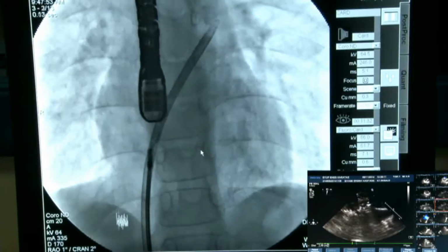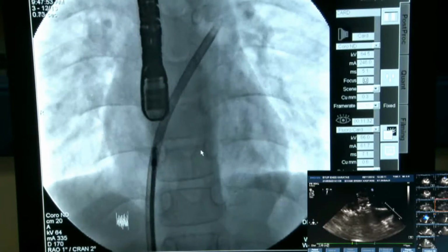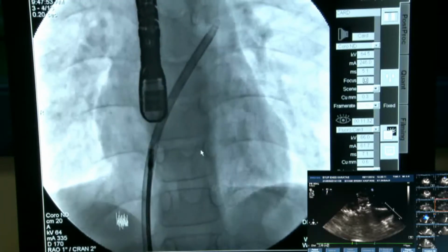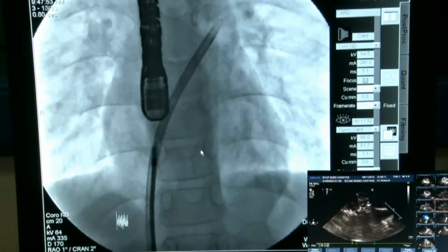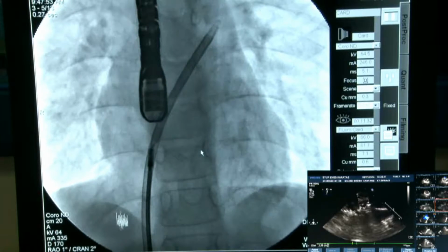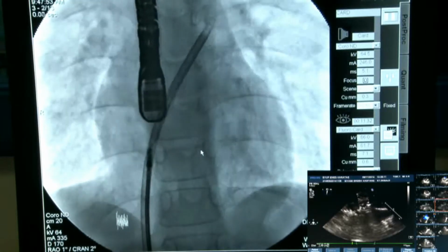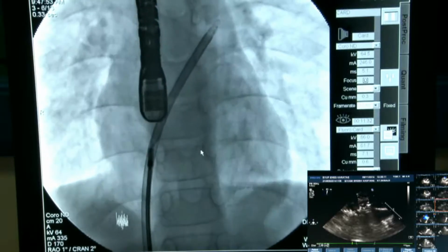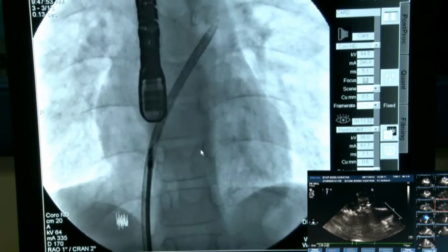We discussed here also to prefer 15 or 16 and a half. And what do you recommend? 15 I think, right? Yeah, I think the salon recommends 15. Okay, so fine? Yeah, they chose a 15 device also, and they already deployed it actually just before we connected to you guys. And can we show the echo live?